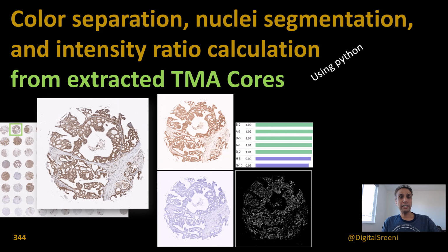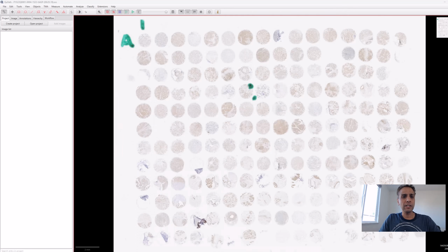Okay, that's a lot of talking. Let's go ahead and jump into the process of extracting the cores quickly and then performing the analysis. And I promise not to make these very long videos, so you're still staying focused throughout the video. Okay, let's jump in. And here is a 1-minute crash course on what we did in the last video.